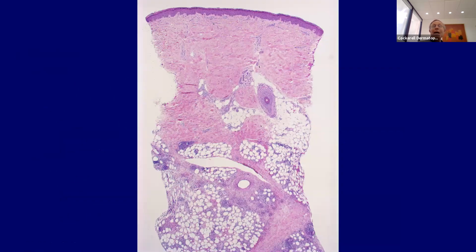And here's a beautiful biopsy. This disease, you should be able to kind of suspect it at low power. You can see right away that the septa are markedly thickened. There should be just a tiny little thin rim or strand of collagen here almost, and this is probably 100 times thicker than it should be. And then you see the periseptal and septal inflammation here.